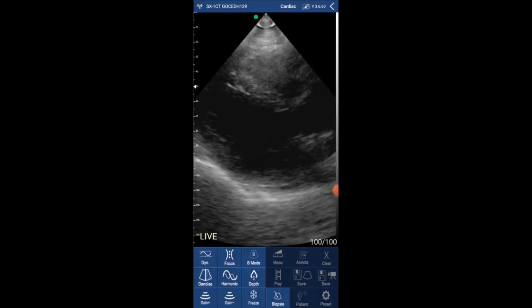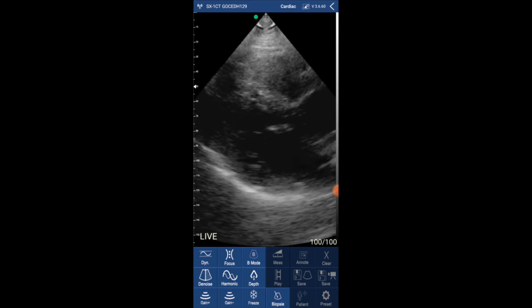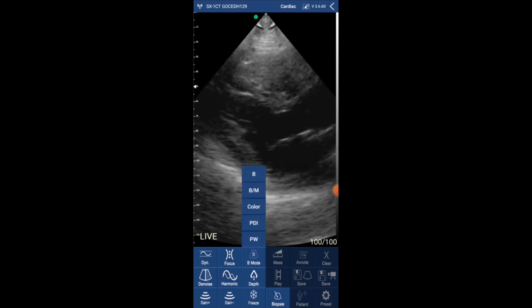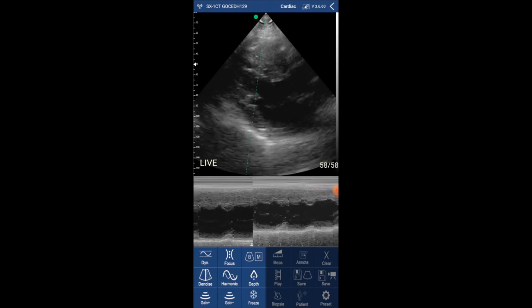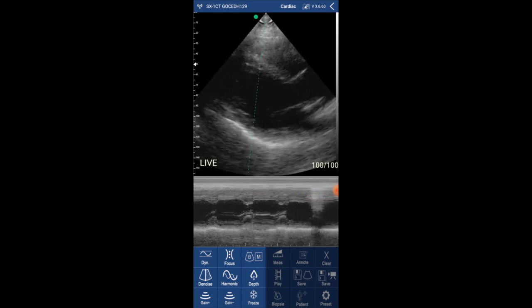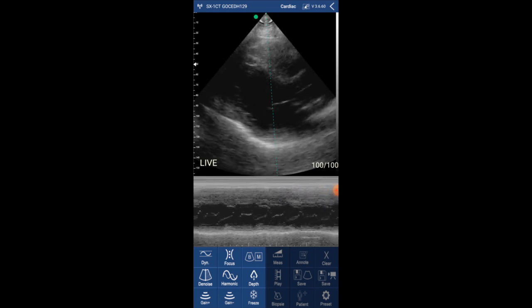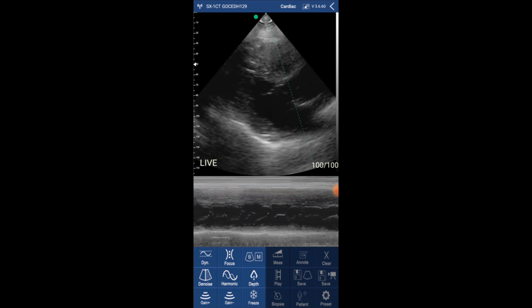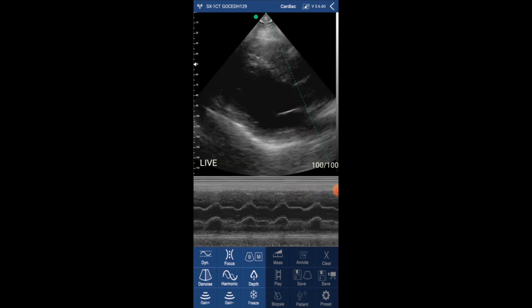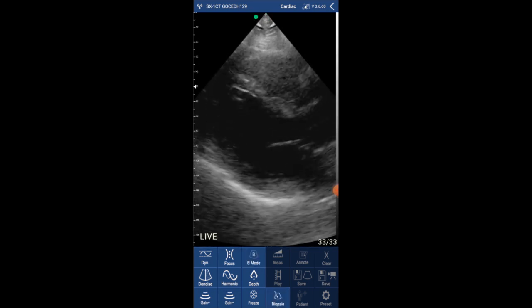I'm going to show you a few videos I took with the Tree Scan Max, starting with this beautiful parasternal long axis view. You can clearly see the chambers and the valves. Now I'm selecting M-mode and placing the cursor across the left ventricle. You can move the cursor in real time. The M-mode of the mitral valve and the aortic valve are very nice — you can clearly see the aortic valve leaflets moving, opening, and closing in M-mode.